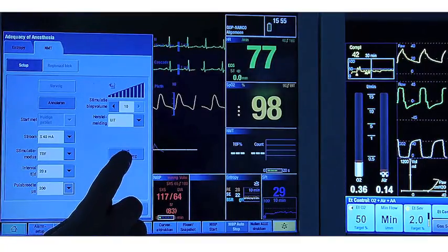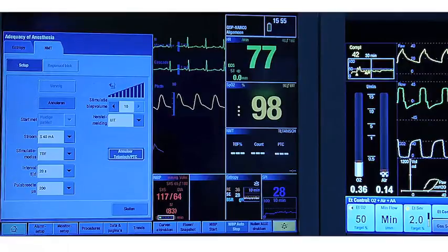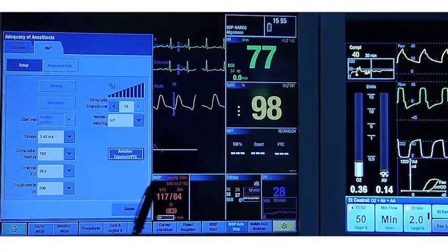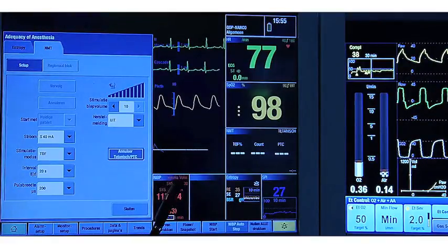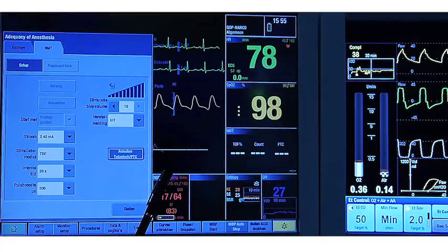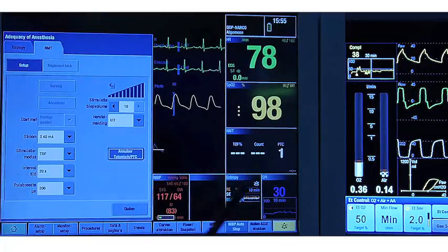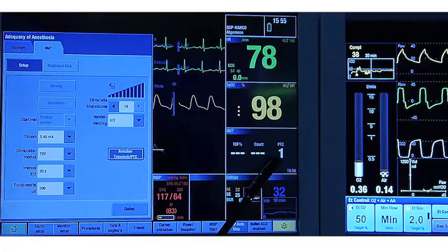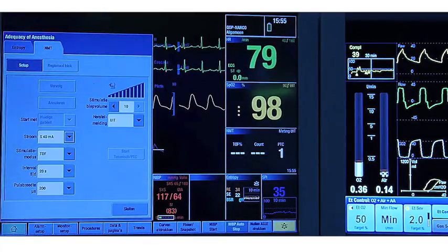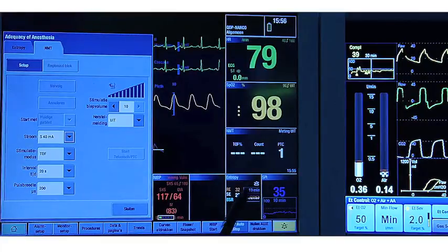Now we do at 200 microseconds. A train of four that is zero. We do a tetanic stimulation and now we start counting the number of post-tetanic counts.